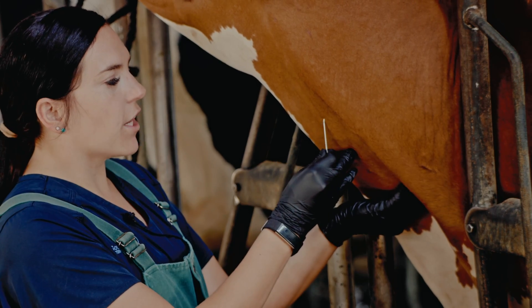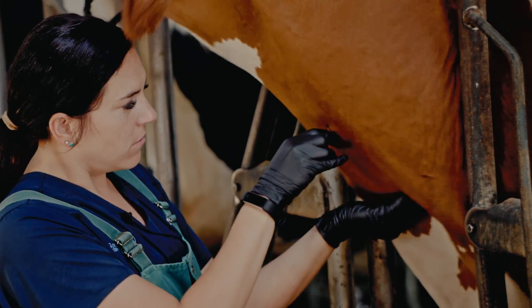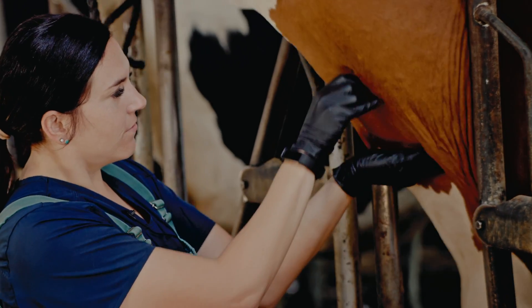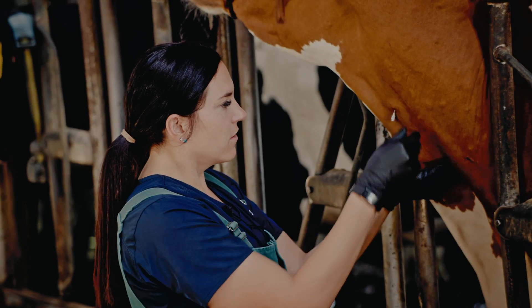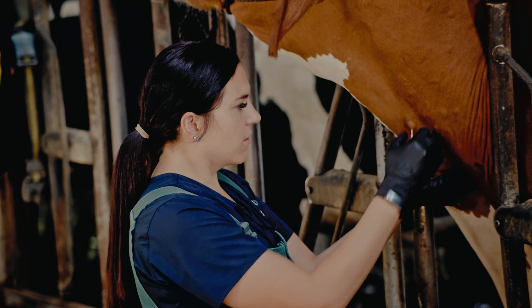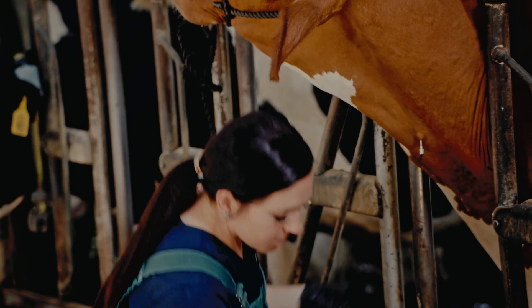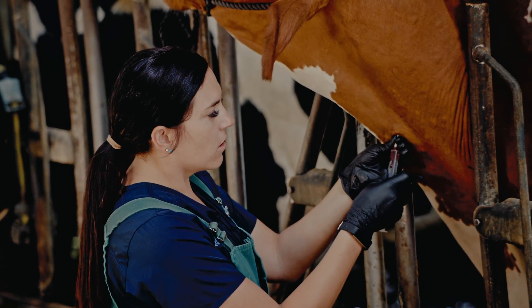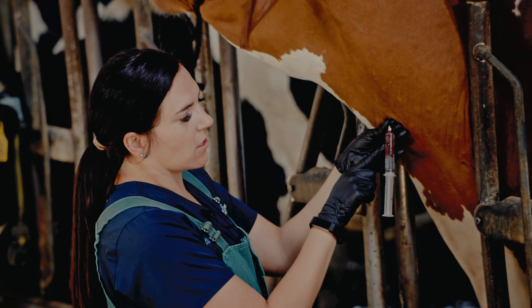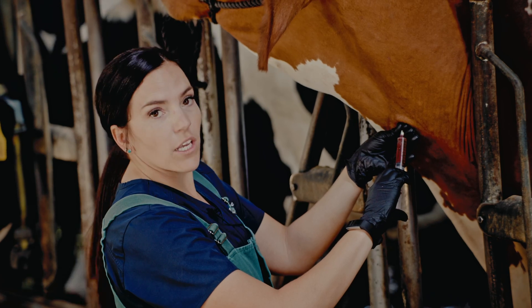At about a 45 degree angle you're going to inject the needle. Sometimes you have to redirect to find the vein. Wait until you see blood flowing from the needle. From there you take your drug, pull back to ensure you're still in the vein — blood will fill into the syringe — then slowly inject.